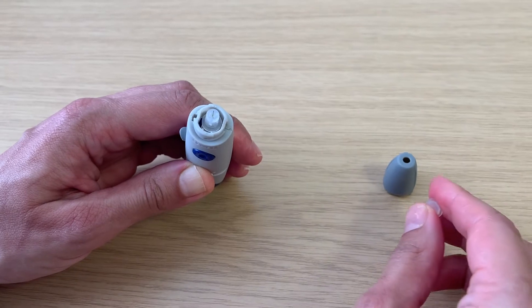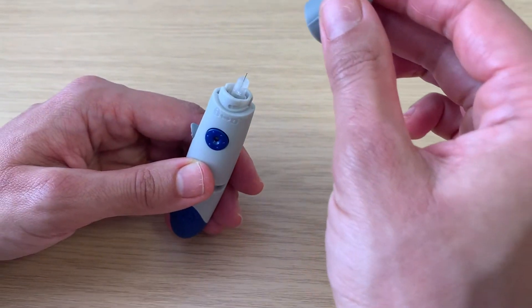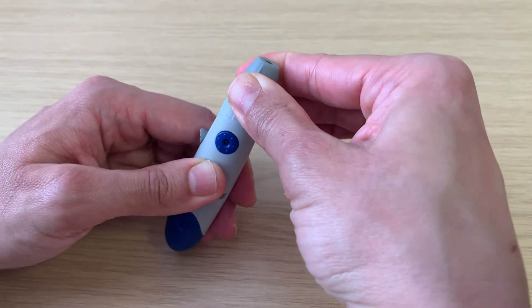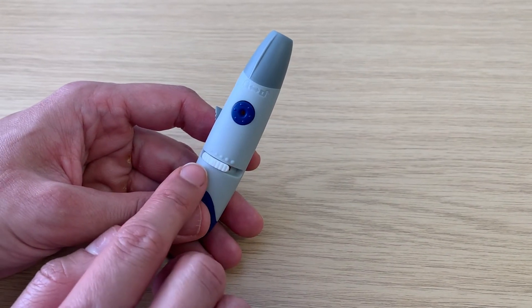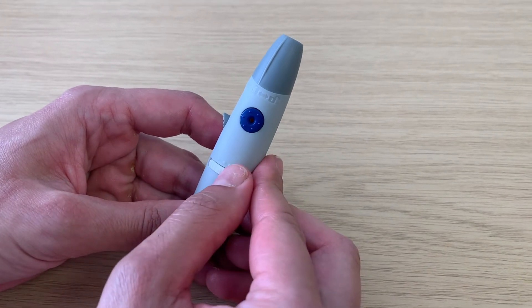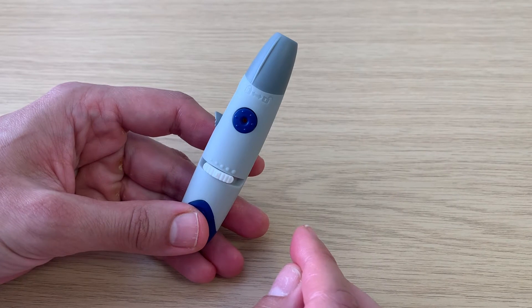You will then see the needle exposed. Place the cap back on by lining up the grooves or raised areas on its side with the blue round button and twisting to the left. Adjust the needle depth using the white side slider. It is recommended to have it in the middle for the first check, and then you can adjust it from there if needed.